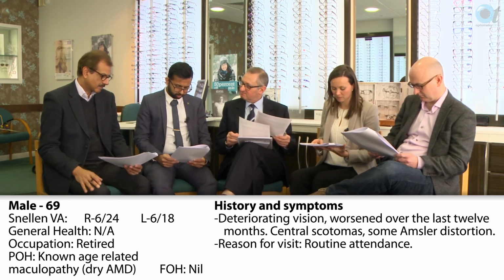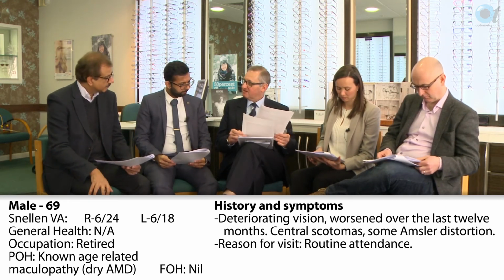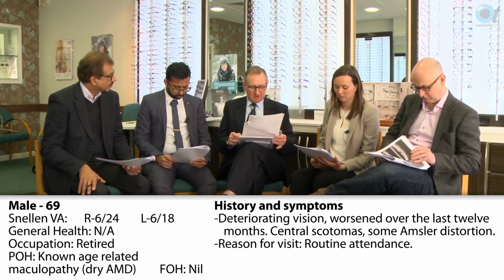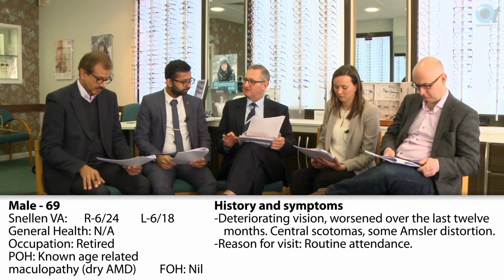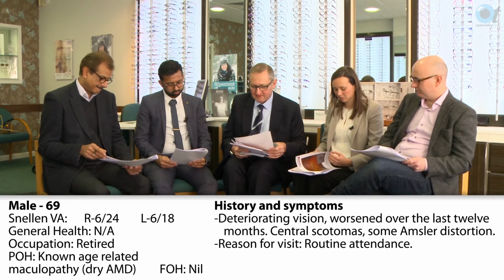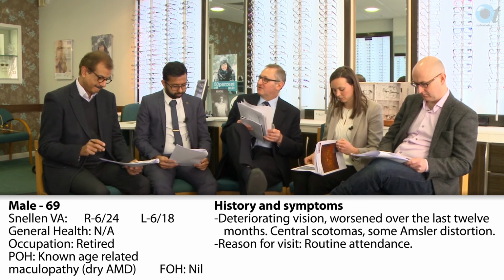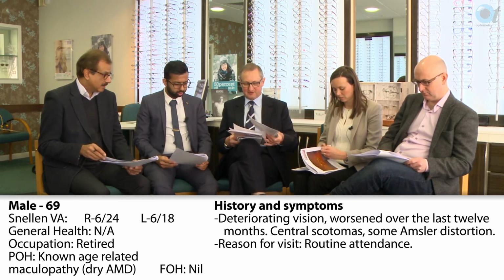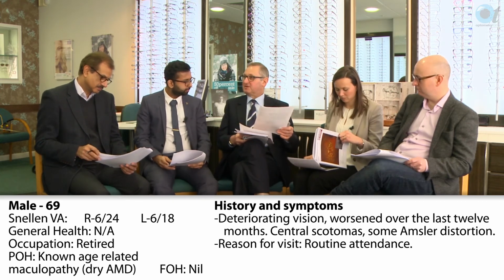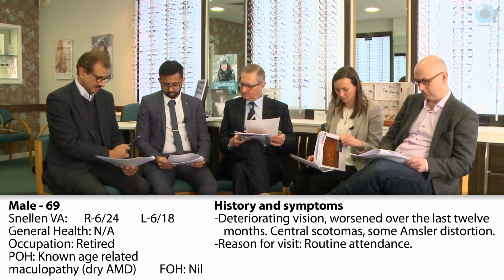So we think this is age-related macular degeneration and maybe a few other things going on, possibly something familial. What will we do with this, bearing in mind this is just a routine visit and we don't really have available any details of his previous acuities at the last visit. Do we know if he had a central scotoma or Amsler distortion last time we saw him? I think he probably did, yeah. Okay, fine, so that hasn't changed. Some Amsler distortion. Yeah, fine.